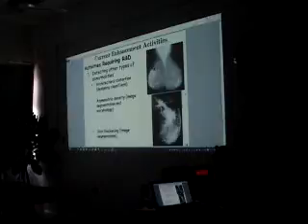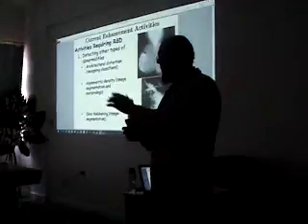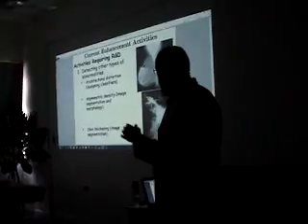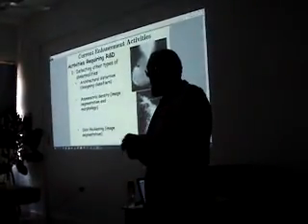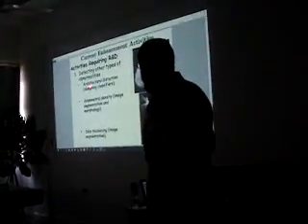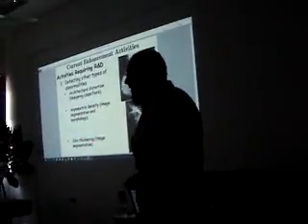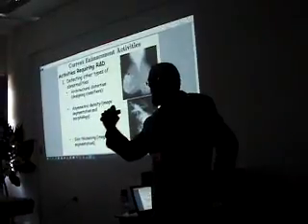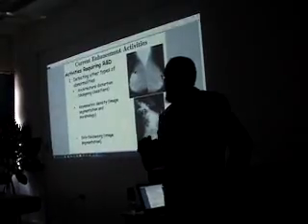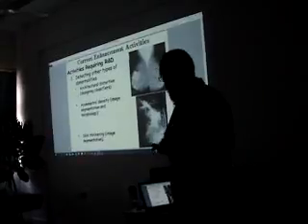So this is almost the research that concluded and produced this commercial product. This is the current research that we are trying to establish to boost the accuracy and the detection capabilities of LibCat to detect other kinds of abnormalities like architectural distortion, asymmetry density, and skin thickening. Those are kinds of cancer as well, but constitute maybe less than 5% of the cancer cases. This is why we deferred this kind of research a little bit, but we are trying to establish it.